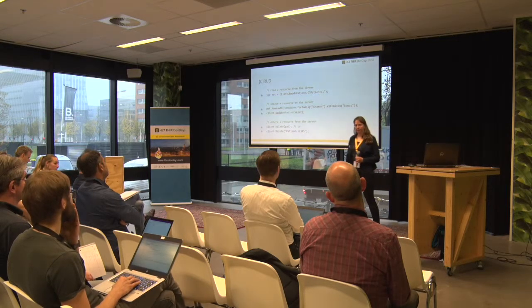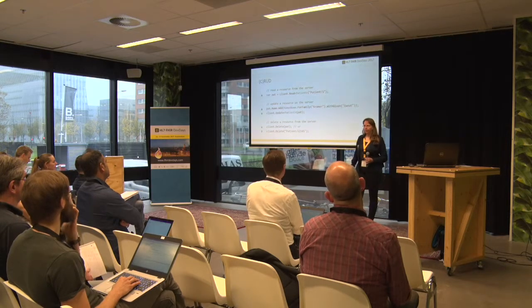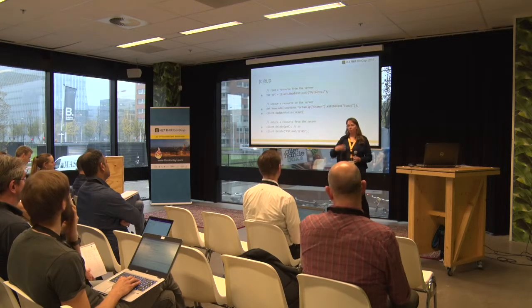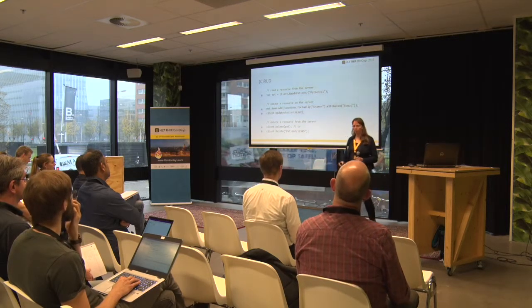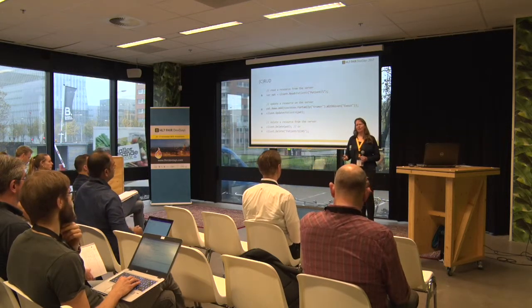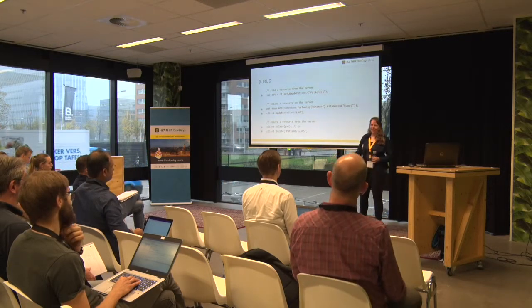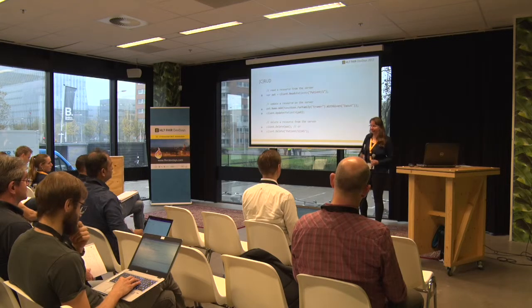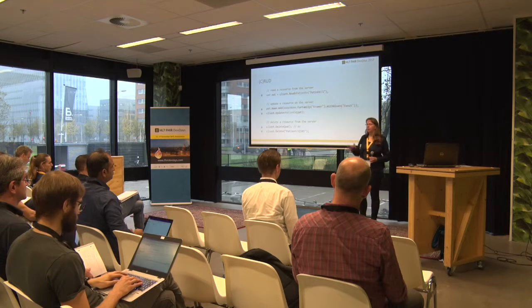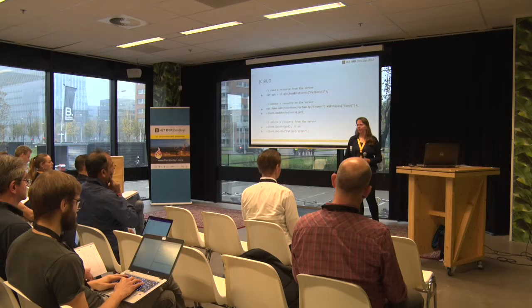Yeah. Only use ID or also the identifier? If you use the identifier, you can, but then it's a conditional delete. And then you will have to supply the correct conditional syntax to look. Well, it's actually a search then on this identifier, and then it will be deleted if it exists. Or perhaps if there are multiple with the same identifier, you will get an error back. But it can be done, but then it's not called a real delete, but it's called a conditional delete. But of course, you can do that with the API as well.